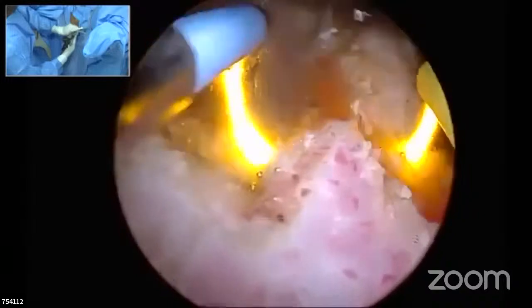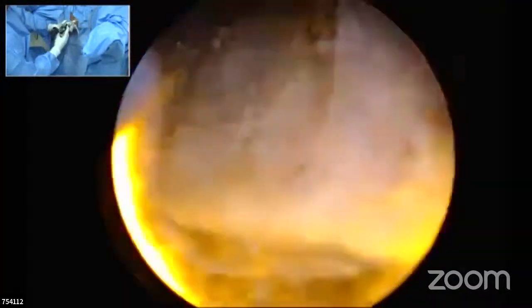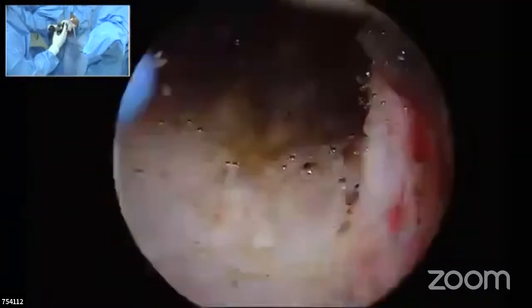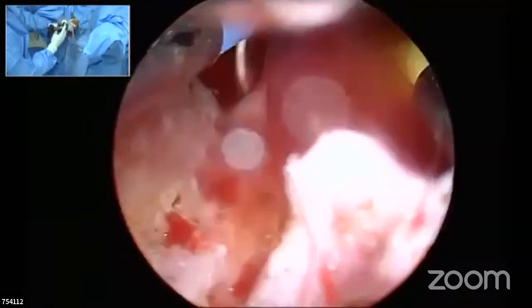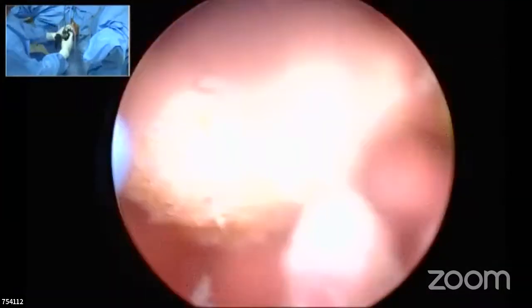Okay. Having done that, and now you see a flattened surface, you start resecting that flattened surface. So you will not be having any lobe which is hanging into the lumen. You will be able to have a clear vision of this lateral surface very well rather than as a groove.